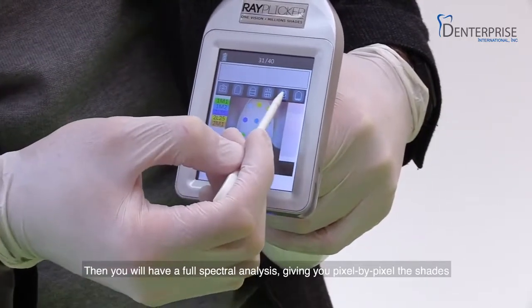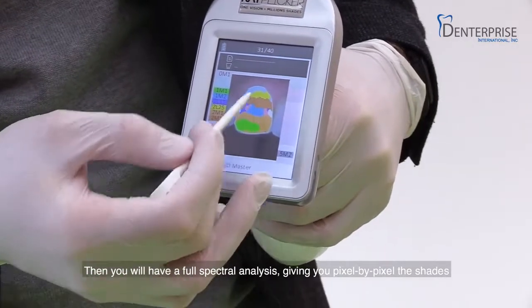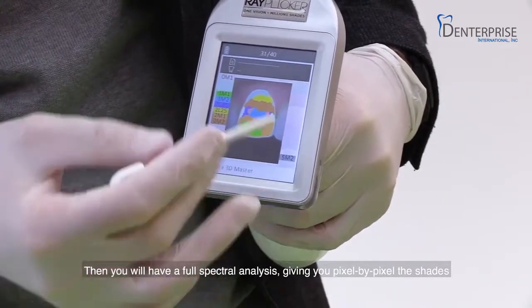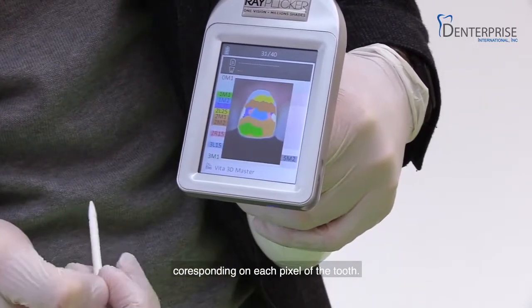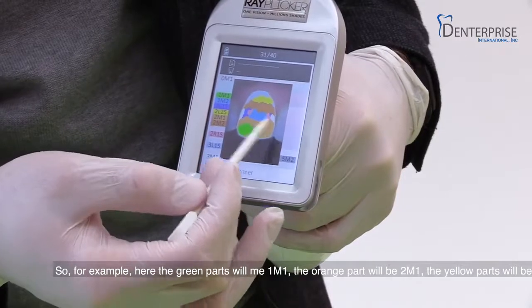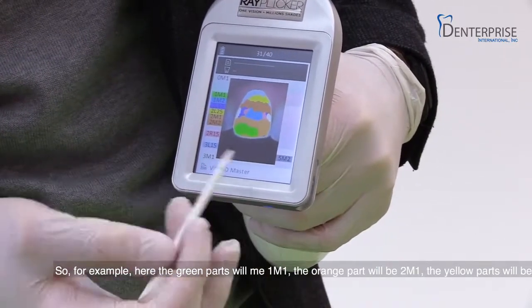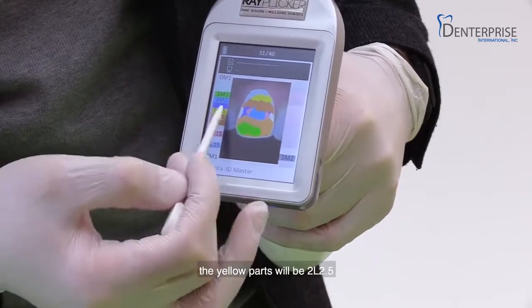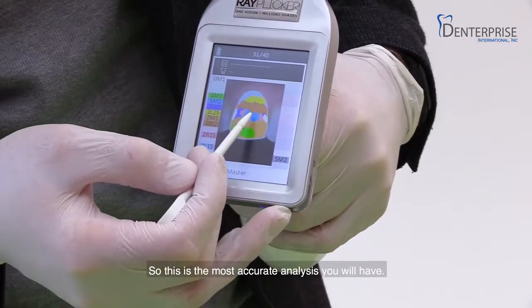Then you will have the full spectral analysis, giving you pixel by pixel the shades corresponding to each pixel of the tooth. So for example, here the green part will be 1M1, the orange part will be 2M1, the yellow part will be 2L2.5. So this is the most accurate analysis you will have.